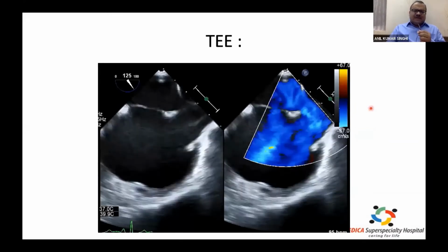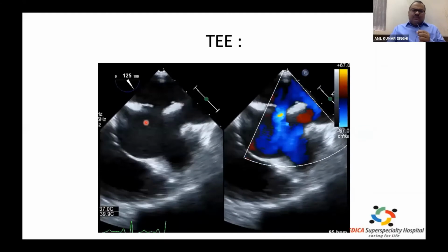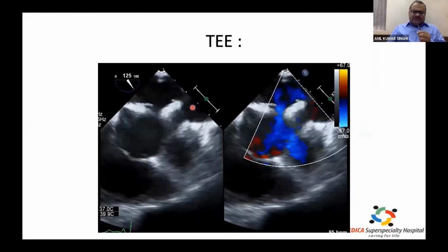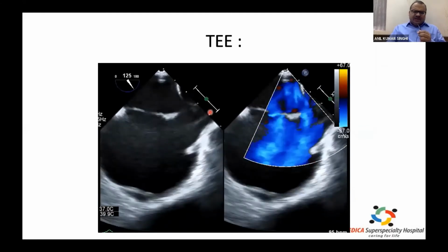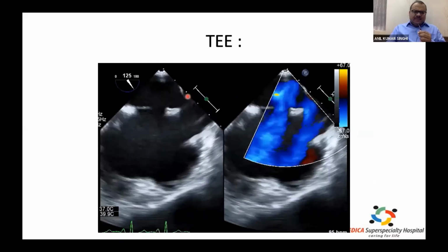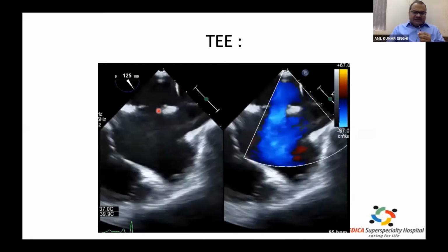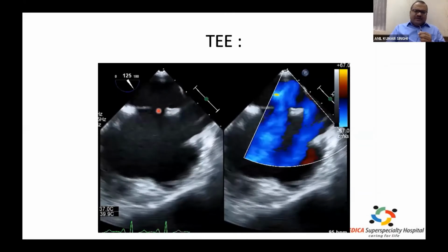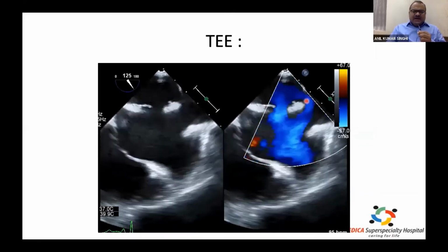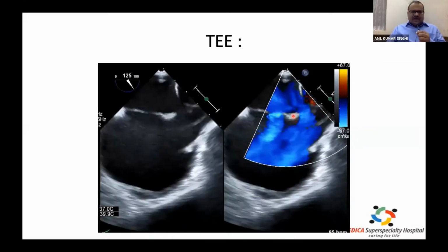So what was happening in this particular case? Now in 125 degree, I could open both the defects. You can appreciate this is the RSVC, this is the septum, this is the aorta. The regular ASD, what we were seeing is around 10, 12, 15 millimeter, but there is a huge sinus venosus ASD above, and these two in combination was the reason for RV dilatation.